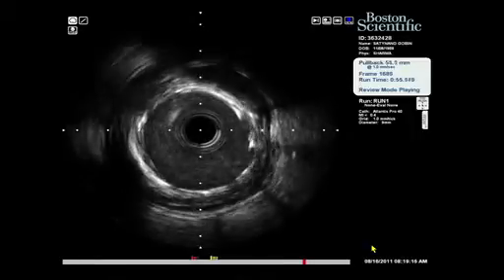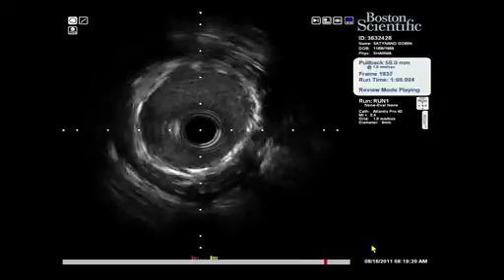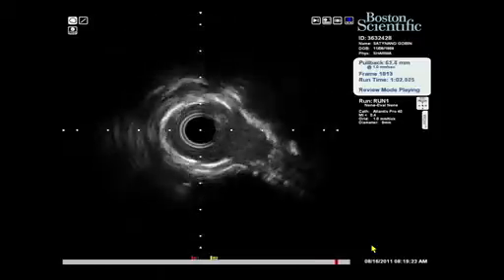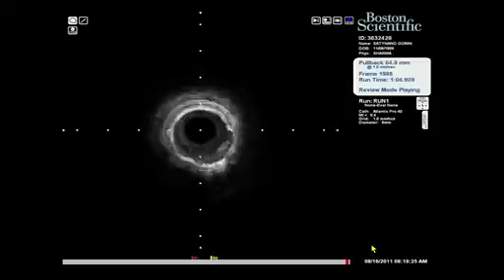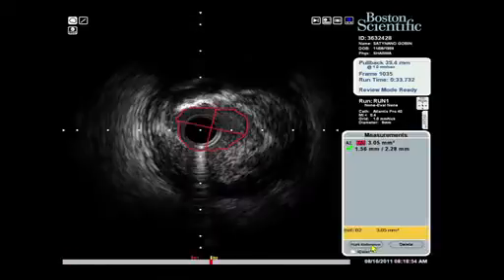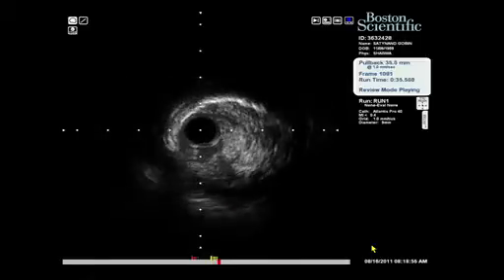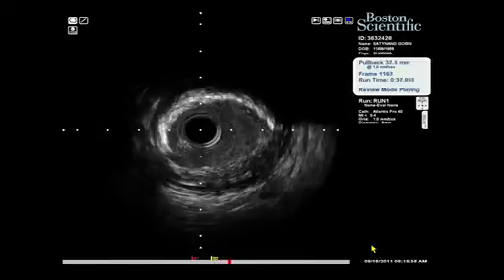And if you can see the IVUS that is playing, this is the proximal portion of the RCA stent. Just go back to where the title is. Yeah, that is where you see what we saw angiographically also, probably mild calcium but a lot of plaque at that particular area, but there was some moderate to severe calcium distal to the lesion. Go to B1, at the level of the B1.